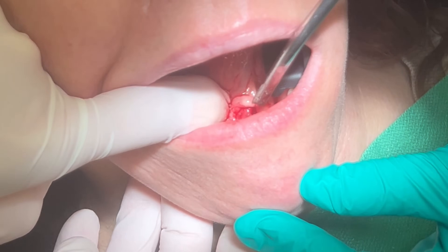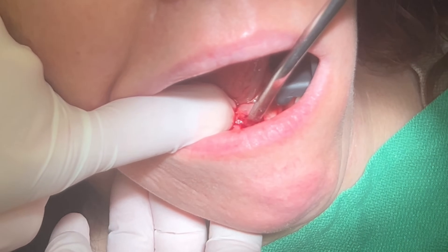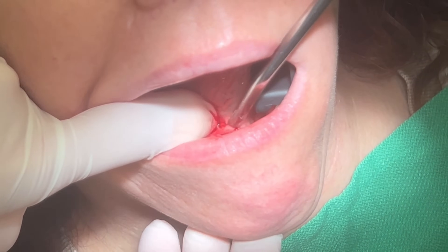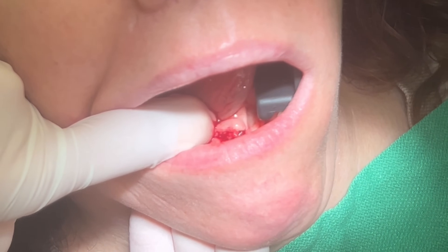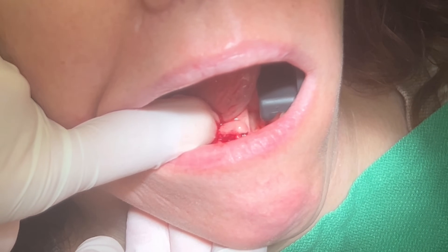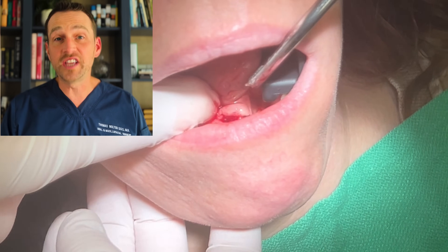There is a healthy amount of flowing mucinous saliva. I leave this area open intentionally — I want the duct to remain flowing while this heals.